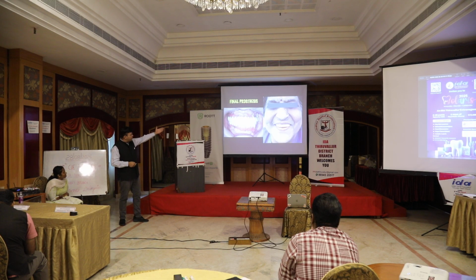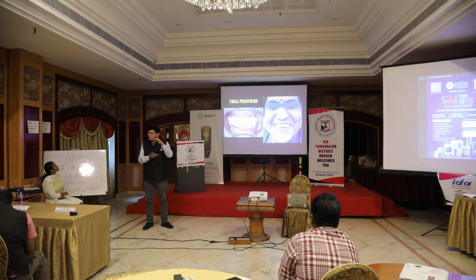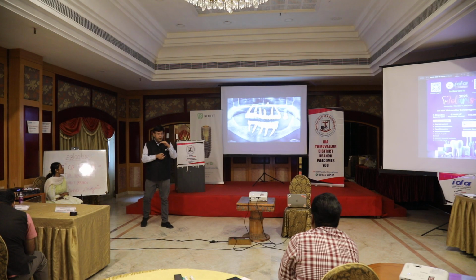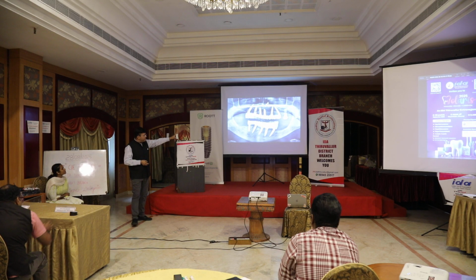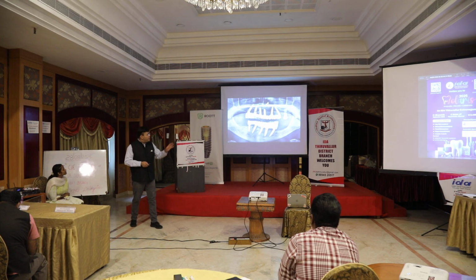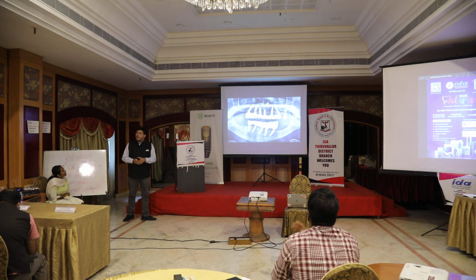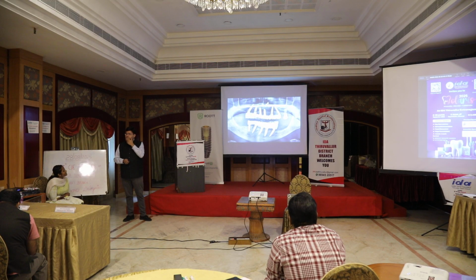Can you see the size of prosthesis for the lower arch? On the left side, huge. That's a fixed prosthesis. It is going to give a lot of load. What was the reason for that? The reason was my implant placement. Right? That precisely was the reason. What will help us if I want to correct this situation? To do a guided workflow.